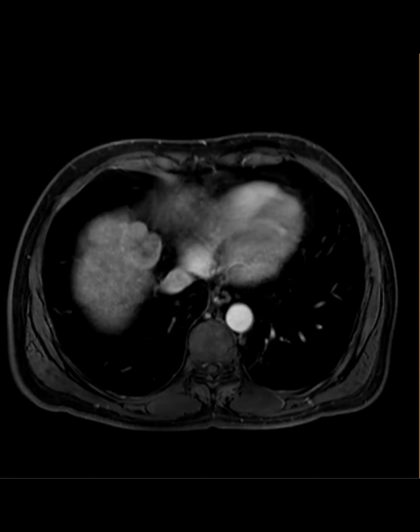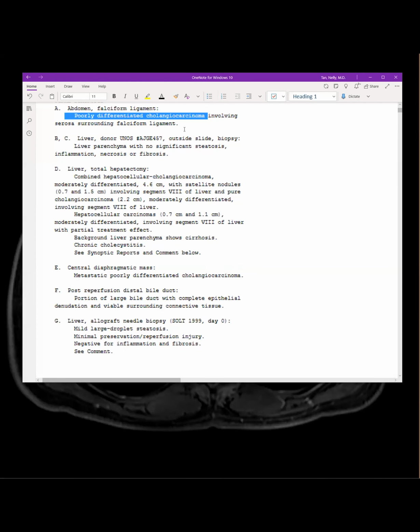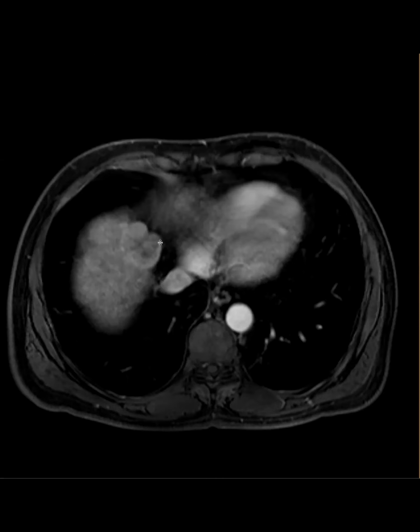And you're right, Victoria. The patient went for a transplant, and it came out as biphenotypic. There was a combined hepatocellular-cholangio, a biphenotypic, and a pure cholangio next to each other. That's a great case. So these were actually 2 lesions. It's almost like a collision tumor. So we reviewed it on the explant, yeah. But they're, like, this is a good example. Oh, is it 2 or 1? And it looks like 1, right? I mean, by imaging. Right.